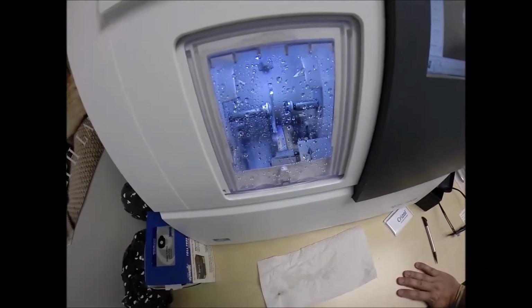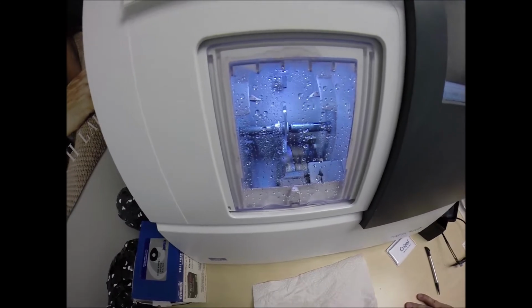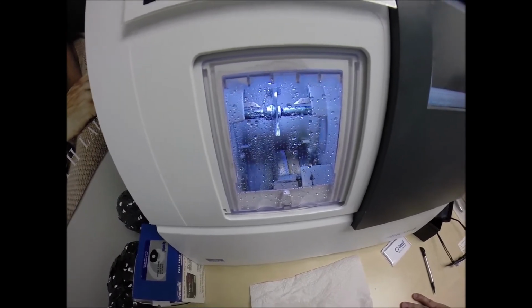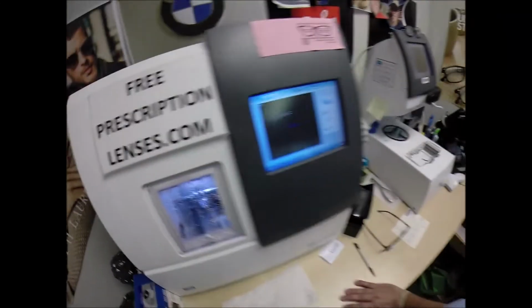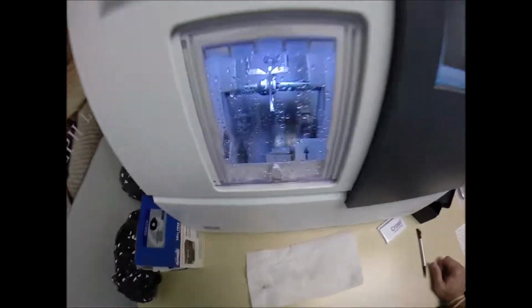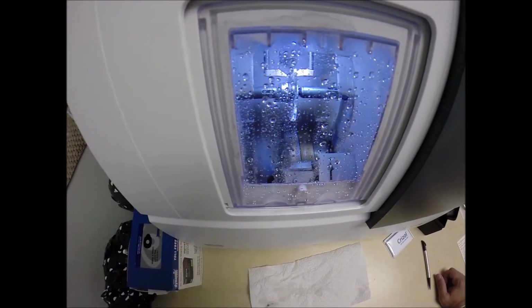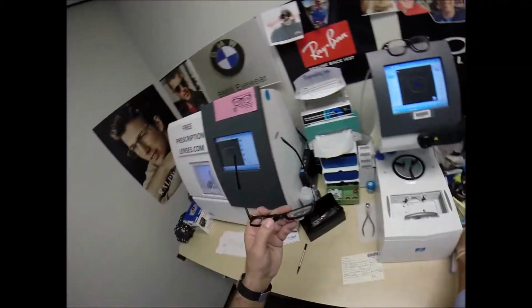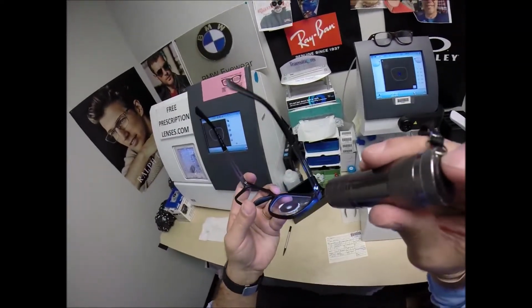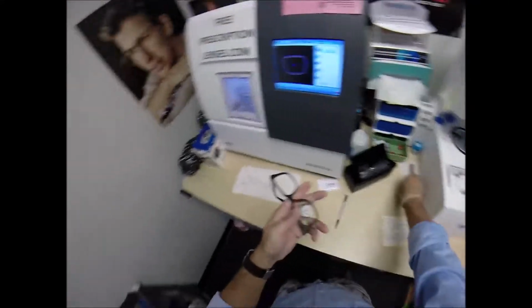The door closes, the clamp shuts, and just like before, the lens will be traced by 2 white styluses, making sure that it's large enough to fit into the frame. And you can see as this goes around tracing the shape of the left lens. And then measuring the thickness where to place the bevel so you have the least amount of edge thickness showing, of which, Karen, you got nothing. 2.5 diopters of astigmatism correction and you have no edge thickness. That's why I have your lenses made as thin as possible.